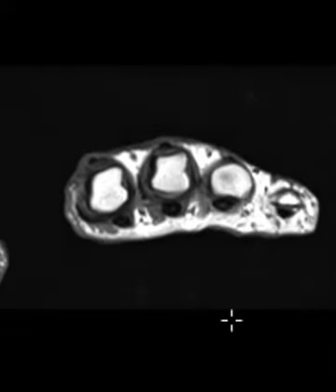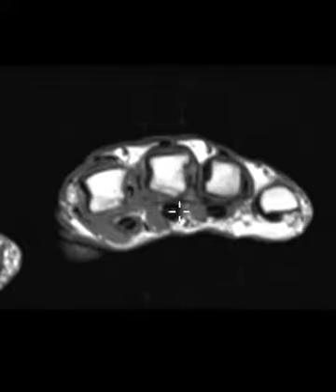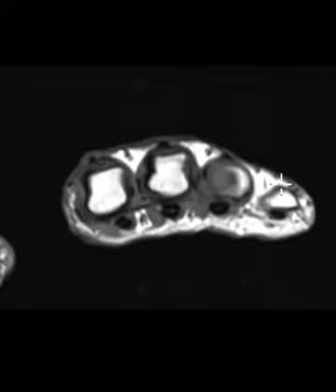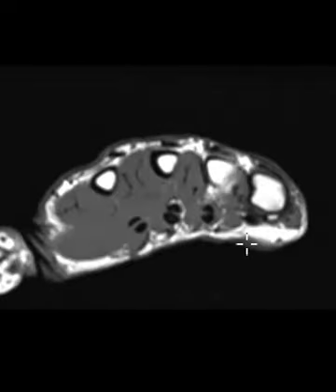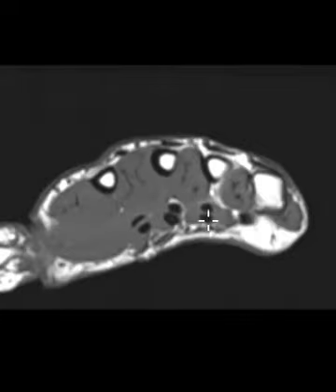And so trigger finger is inflammation of the tendon sheath, and on this view, this is a short axis view where we see the flexor tendons over here in the palm. This is the second, third, fourth, fifth fingers. The extensor tendons are over here, the flexor tendons are here, and the flexor tendons are paired. We have a deep and superficial. So it's called the profundus, and this is the superficialis, the flexor digitorum tendons.